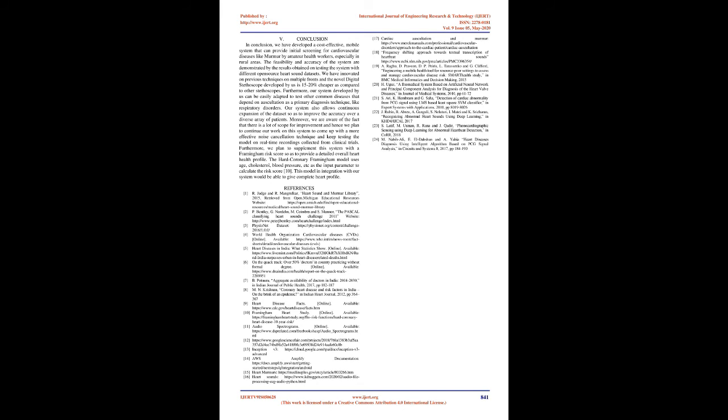Experiment 2: PASCAL dataset. PASCAL dataset A: 31 normal and 34 abnormal heart sound files. After pre-processing, segmentation, and spectrogram conversion, a training set containing 47 images and a validation set containing 11 images was created. After 25 epochs we got a validation accuracy of 81.82%.